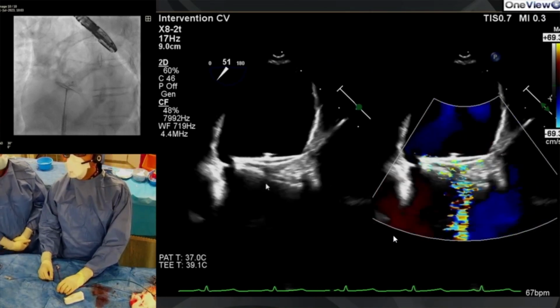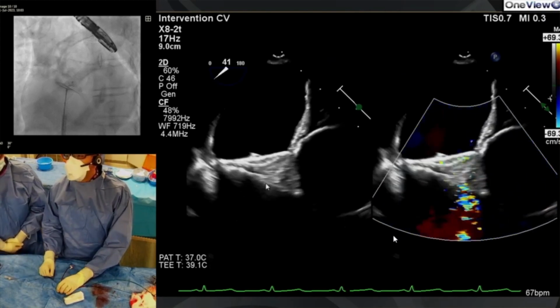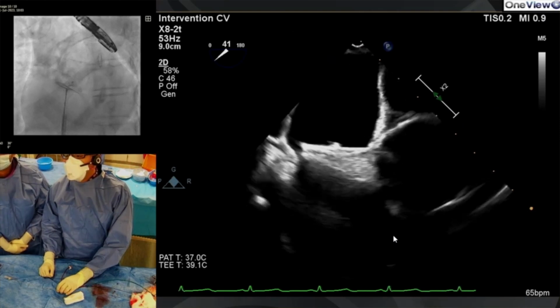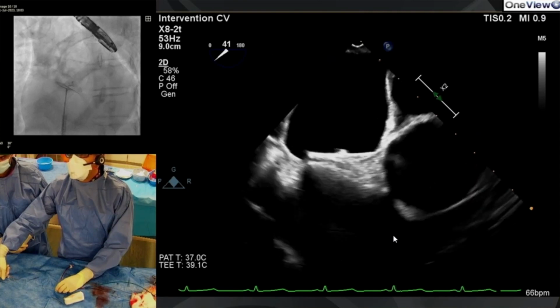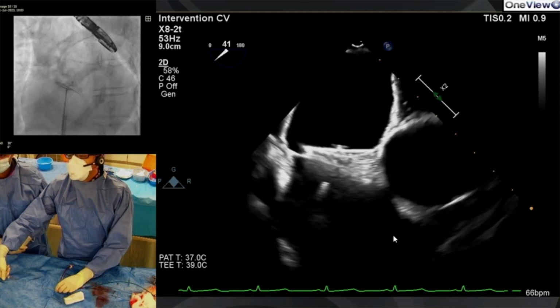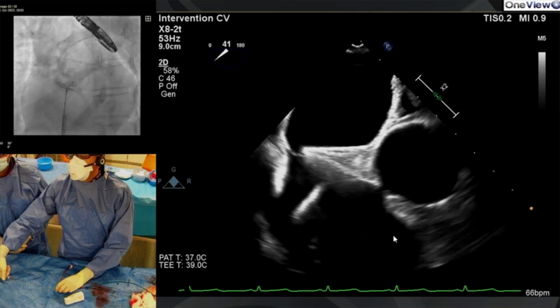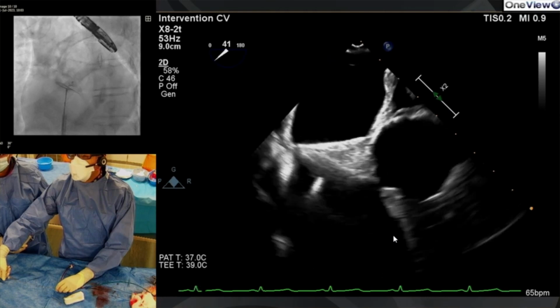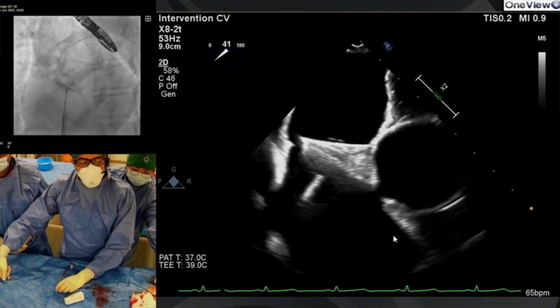So we have seen that the device does move a little bit more on release than the other 2 devices. And just on the point about non-self-centering with a PFO type device, obviously the size of the PFO, we've got potentially 7-8 millimeters on one end. It gets to 10 millimeters in the middle on the 3D I'm talking, and then 18. But when we balloon size, the main widest opening was 10. So the fact that we've got a bigger opening on the RA side, it shouldn't be an issue because we've sealed the PFO from the LA side quite clearly.